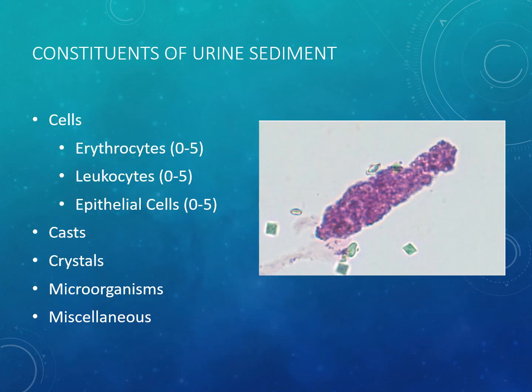And just about the sediment, again, real quick, these are some of the things that you can see. It is very important to do the sediment analysis because a lot of things we're looking for, like casts and crystals and microorganisms, cannot be detected on our reagent strip, or by simply looking at the urine.